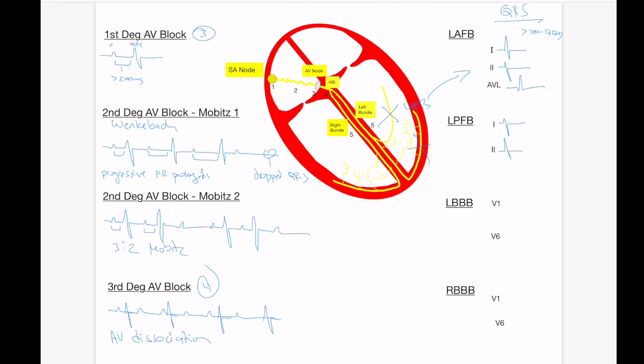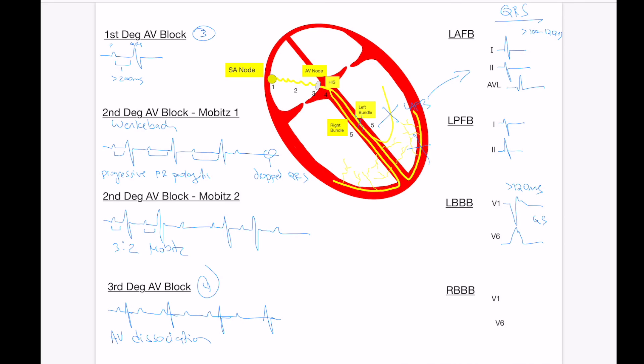Moving on to left bundle, so if your entire left bundle upstream is blocked, you will get a complete left bundle branch block. You're going to see a QRS duration of greater than 120 milliseconds, and how you're going to distinguish between the left bundle and the right bundle is really looking at two leads, lead V1 and V6. In lead V1, a left bundle is going to give you a QS complex, so you're going to have a QS complex, you're not going to have an R wave here, and it's going to be broad and wide, essentially just one big Q wave. Lead V6 is sort of the opposite, you're going to get this RS complex, where you're going to get a broad, often a notched R wave, indicative of the conduction delay.